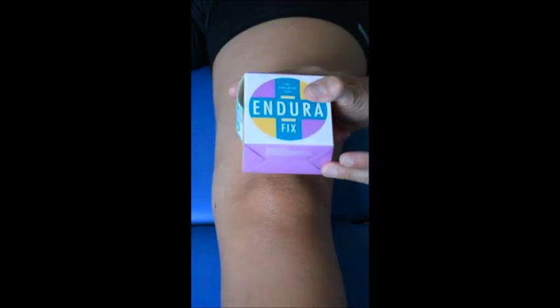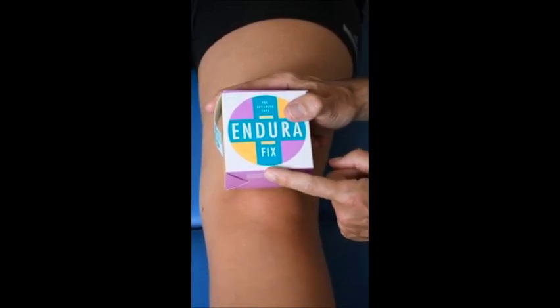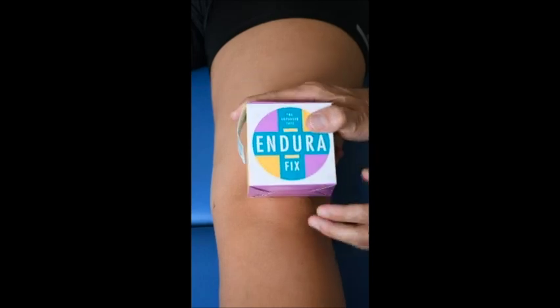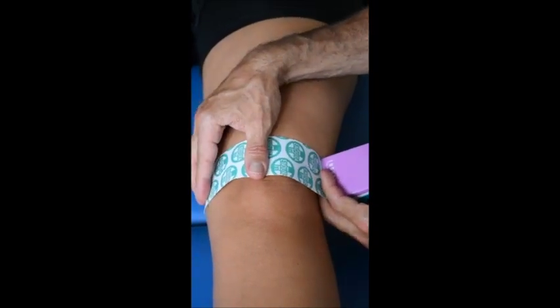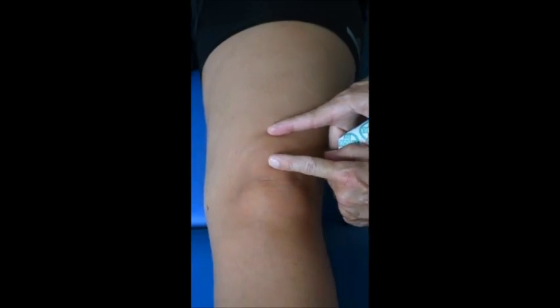How do we correct an AP tilt? Which means a patella which is sitting in this position, and where very frequently the apex patella, the inferior border of the patella, is irritating the Hoffa fat pad. Well, basically we want to lift off or lift up the apex patella from the fat pad. So this time we will measure again the quantity of fix we need, the skin protector, and this time we will place the tape not over the patella but a little bit above.